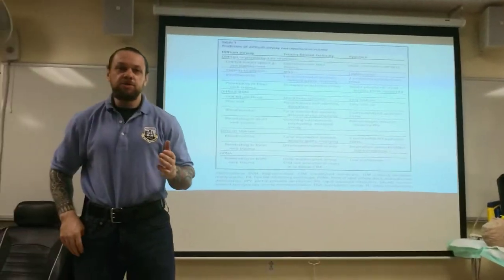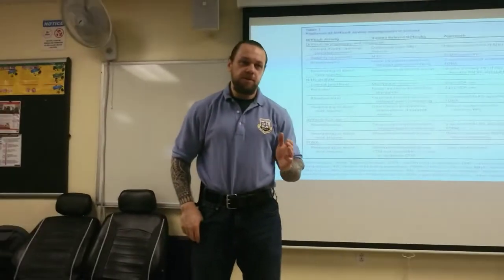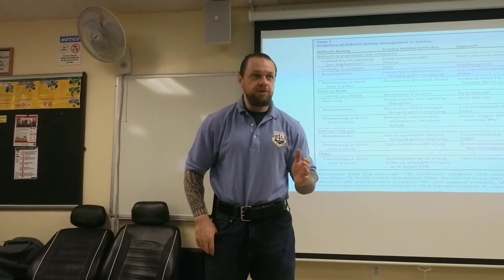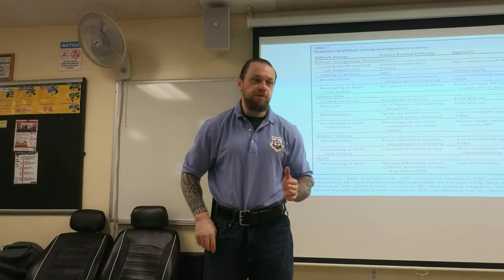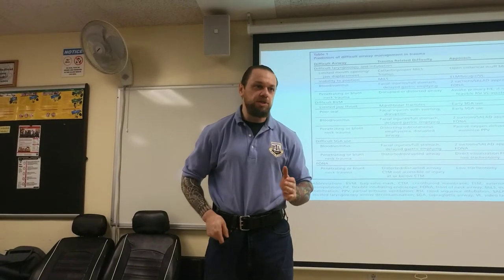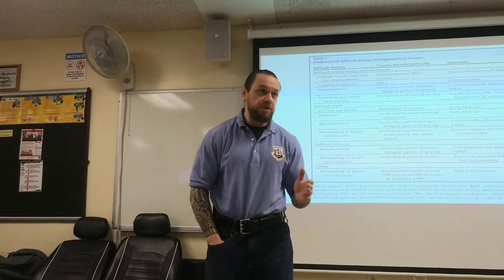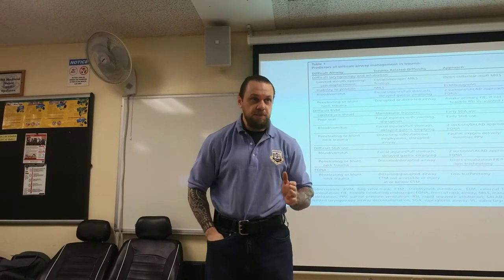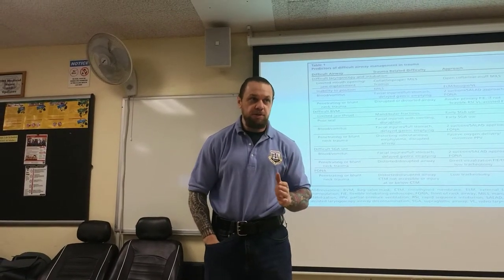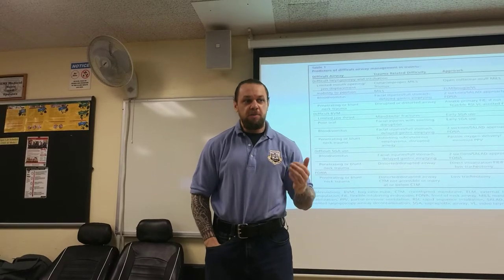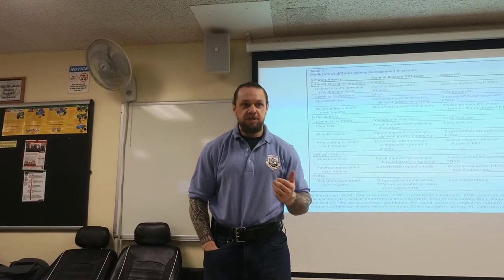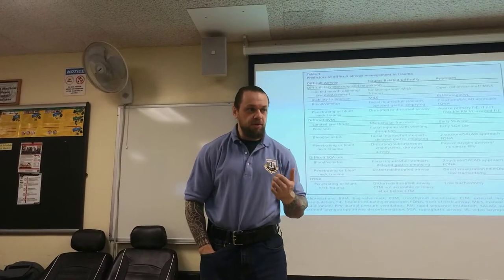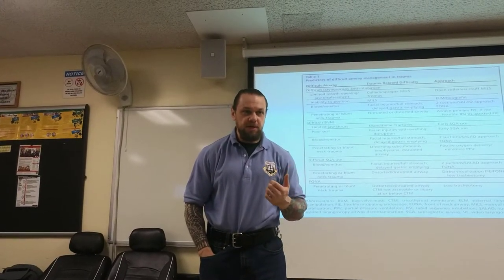Good morning again. I will show you the steps for intubation for someone who has a potential cervical spine injury and trauma. The second skill we're also going to do is a patient who has a contaminated airway — possible blood or vomit in the airway.